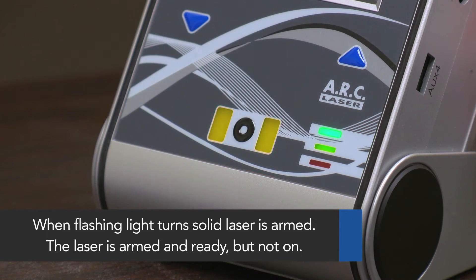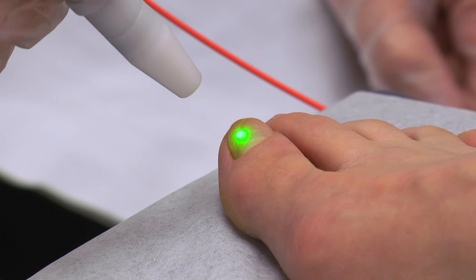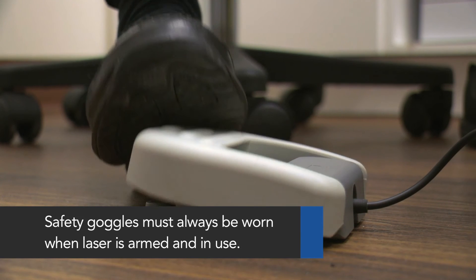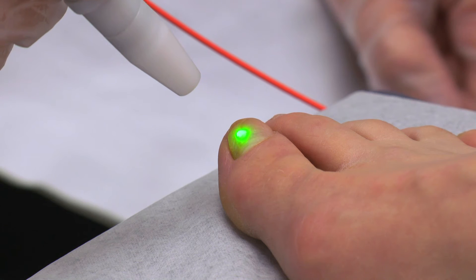Arm the laser by putting the device into ready mode. The laser is armed, but not on, when the light is solid. The green aiming beam will also appear from the handpiece when the laser is armed. Next, open the safety cover on the foot pedal. Make sure the handpiece and indicator are pointed at the toe to be treated and is held one to one and a half centimeters from the nail's surface.